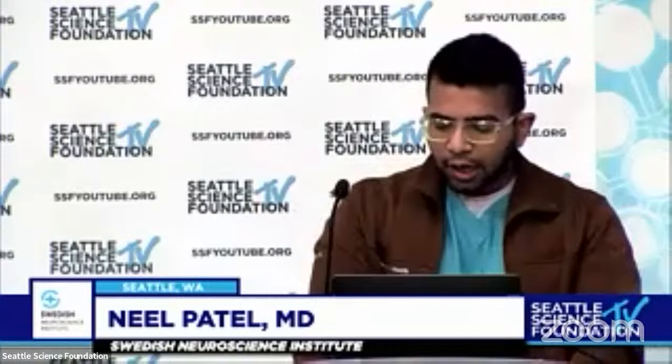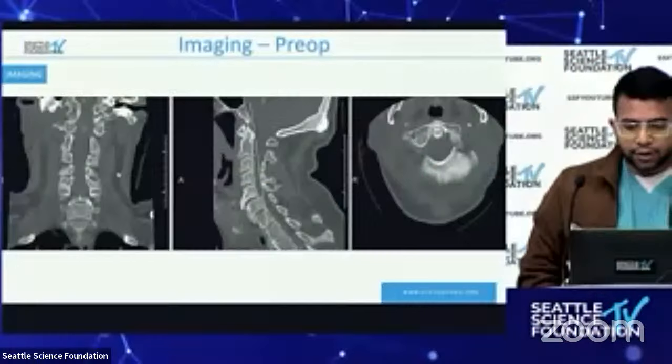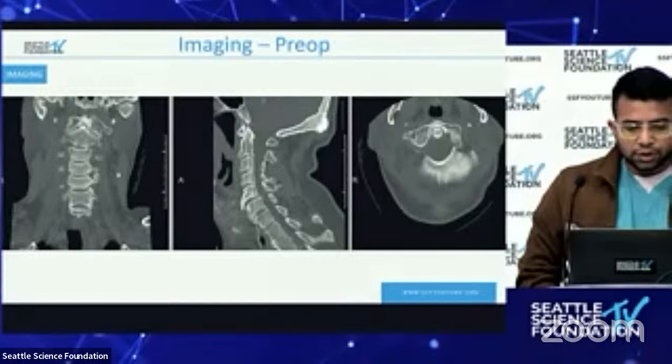Great. Thanks, man. All right, so my case for today is a 55-year-old male who fell in the shower. And this is all the history we got. He was kind of out of it for a while and we didn't have anything else with us. It presented as a trauma, is intact on exam, and had, again, no significant pertinent labs, and got part of the trauma workup, got a head CT, got cervical CT, and this is the first image that they obtained before calling us. So you can see a C2 fracture.